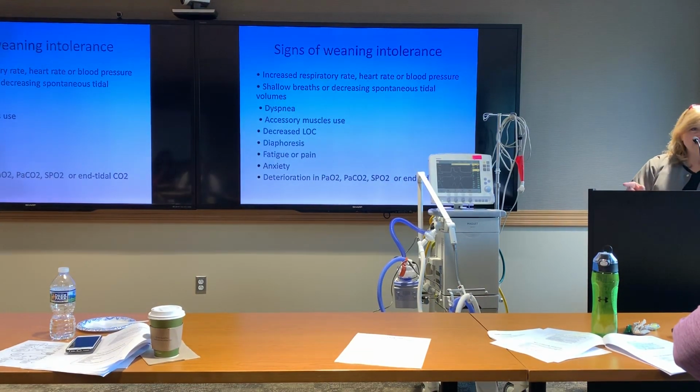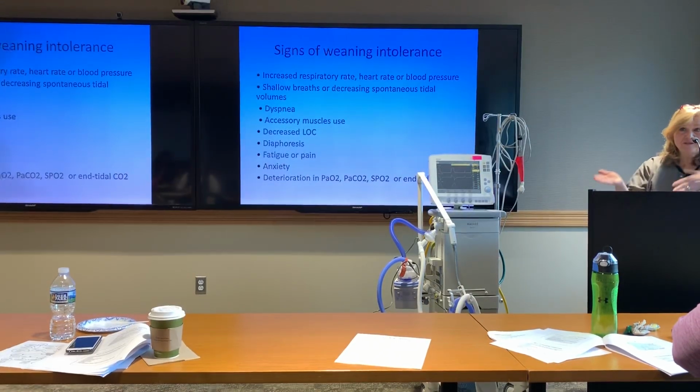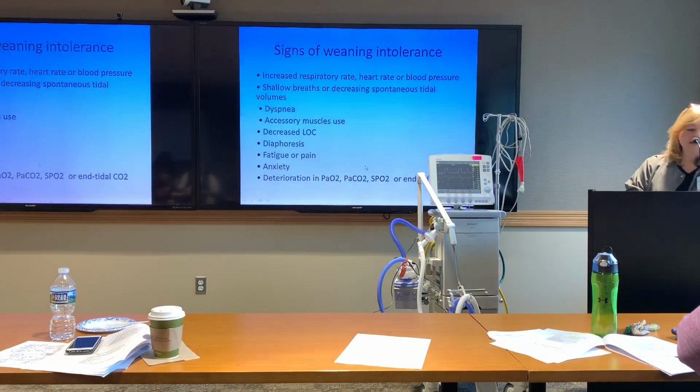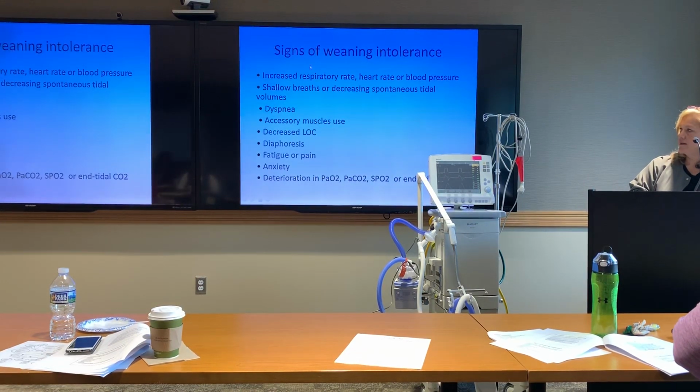Level of consciousness changes from before the trial to during the trial. Obviously we'd want to stop that trial at that point because it's not going well. They get diaphoretic, they complain of extra fatigue, or they get really anxious, different things like that. Or if the blood gases or the SATs drop. Obviously these are not good things.